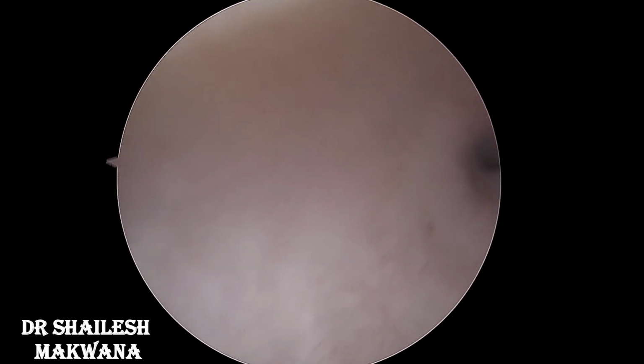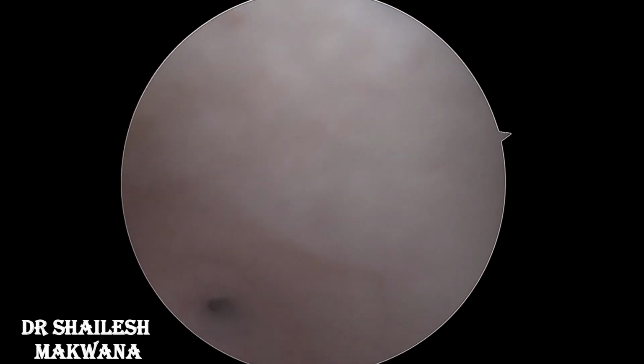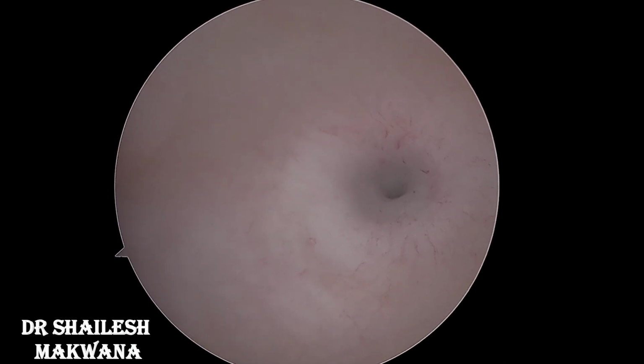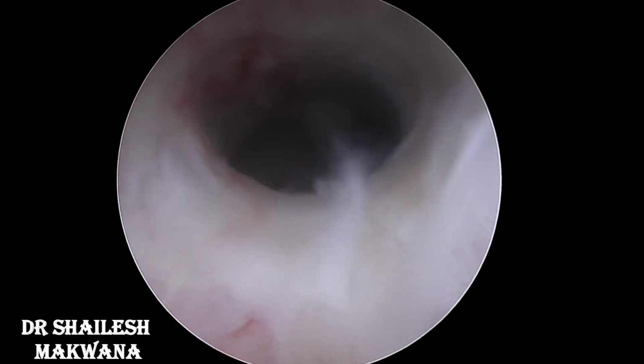And the first thing that you need to see is the presence of adhesions or synechial bands at the level of fundus or uterus. So we saw the uterine cavity, it was normal, both the tubal ostia were normal. So we just proceeded with the checking of the anterior and posterior walls, and we proceeded back to check the cervical canal for any narrowing.